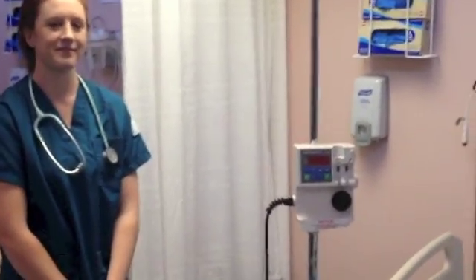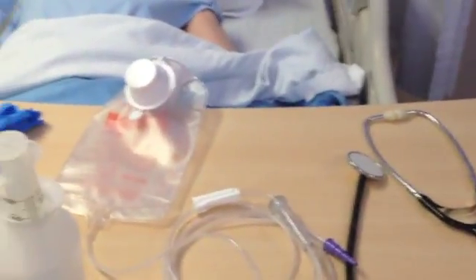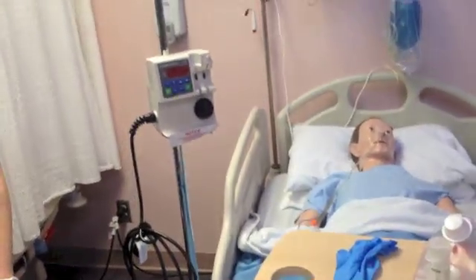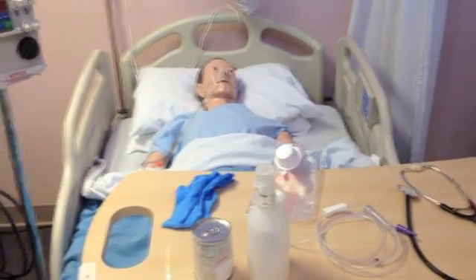The supplies we will need for this procedure include, first of all, our feeding pump, formula, a feeding bag and tubing, a 30 milliliter or larger syringe, a stethoscope, and pH testing strips. We also want to verify that our current setup is no older than 24 hours.